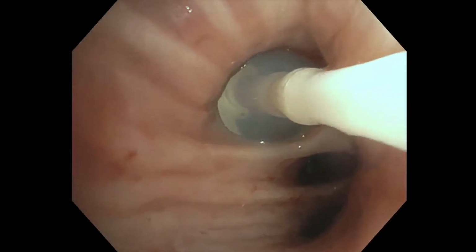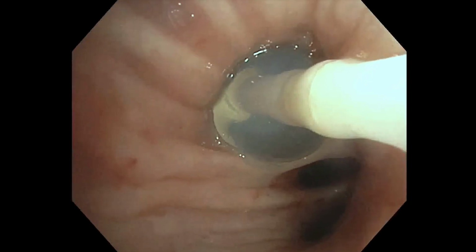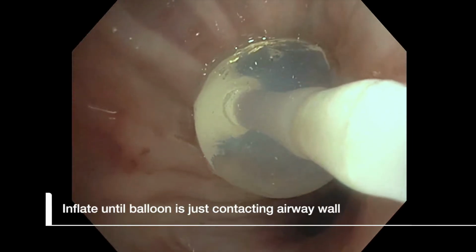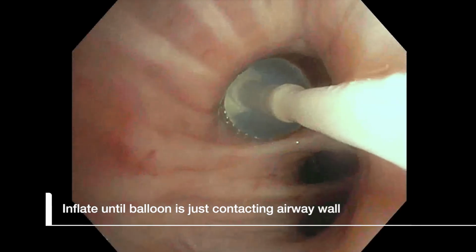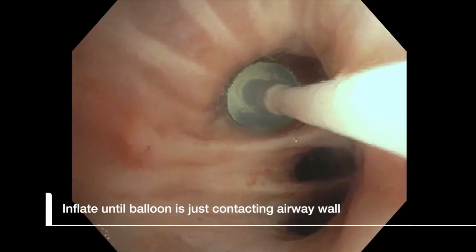Inflate the balloon until it is contacting the entire circumference of the target site. The bronchoscopist should feel a slight tug when moving the catheter back and forth to assure a good fit, taking care not to over or underinflate, as this can result in the selection of an improper valve size.